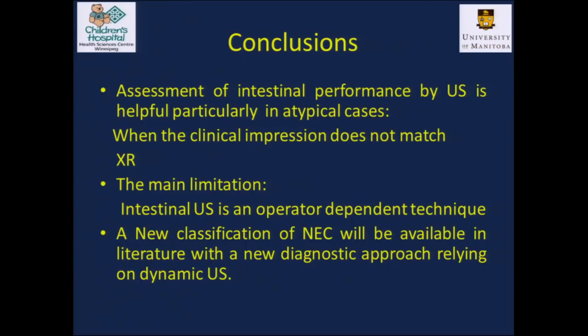the abdomen. A new classification of NEC will be available in the literature, the one that I described in the previous slide, with a new diagnostic approach relying mainly on dynamic ultrasound.